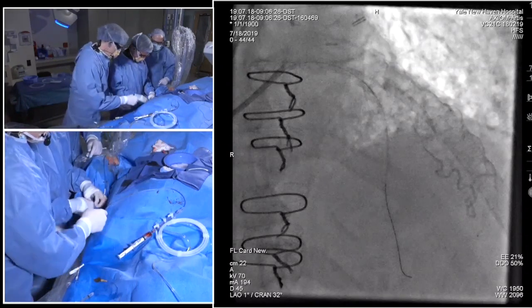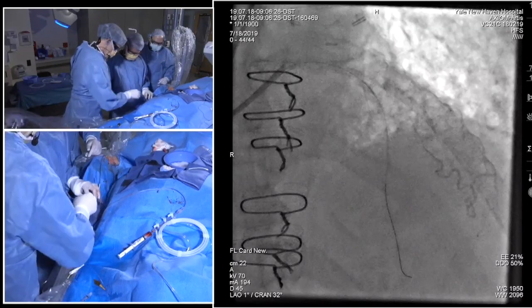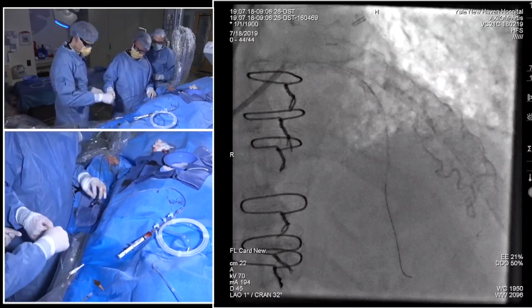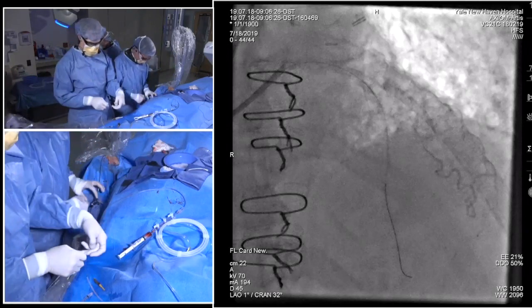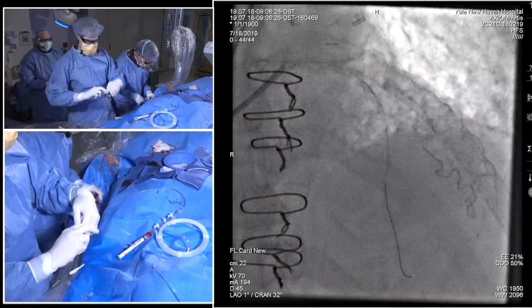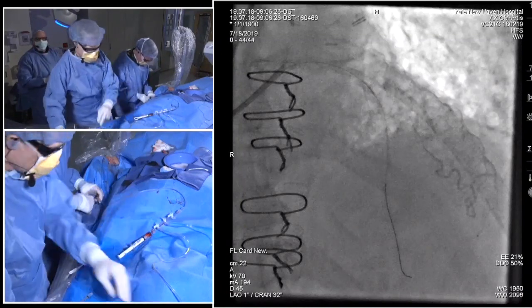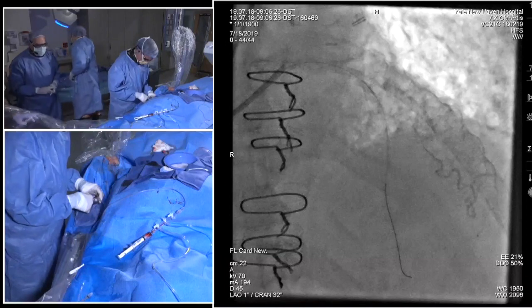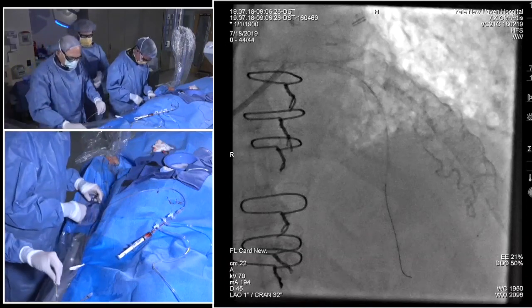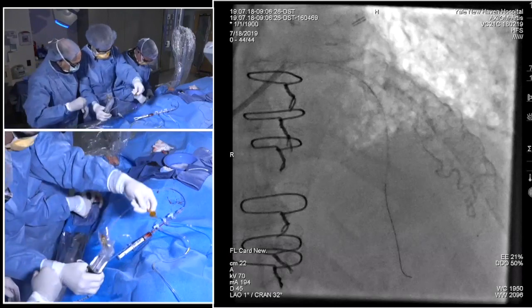And just to comment on the 125 burr, there was a nice case presentation this morning where someone commented that the 1.5 wouldn't make a corner in a right coronary, and so they didn't want to go to the 125, but ultimately chose to there. And I think there's a number of times where just that patience of taking your time and doing a few more runs on the 1.5, a lot of times it will go, but they had a case where the 125 did get entrapped and had to deal with that mess in a perf. But anyway, so good points.